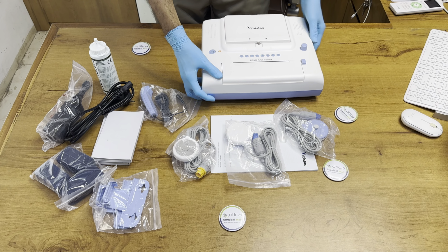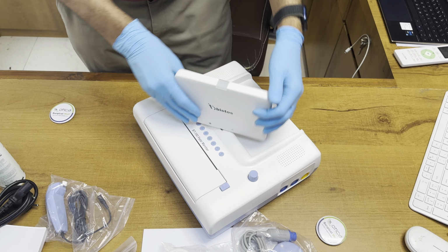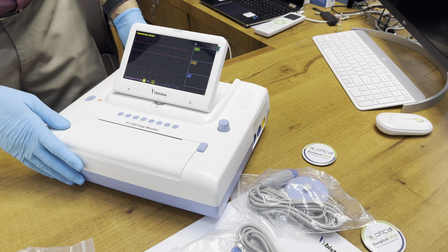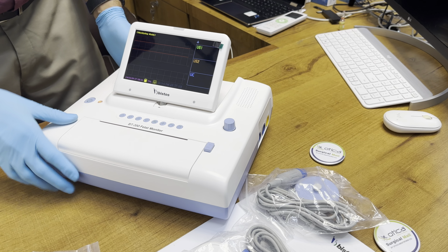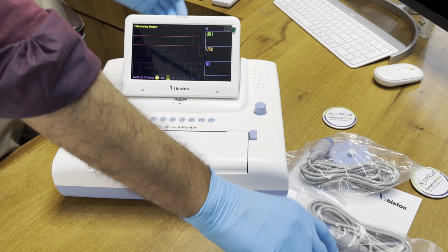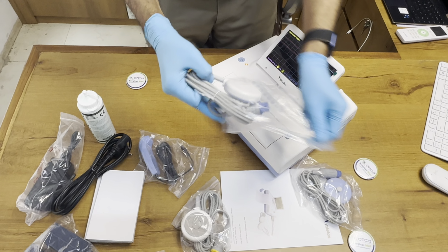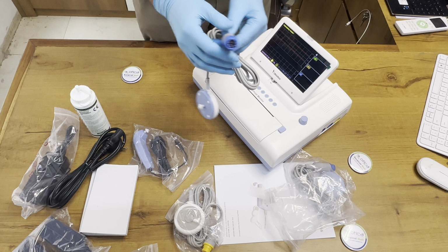So you can see this is the machine. The display is folding and rotatable, and we can adjust it according to our requirement. So this is how the various functions are given. This is ultrasound 1, ultrasound 2, and this is the tocography probe. So first of all, let me open the things. This is the toco probe. No, sorry, this is an FHR probe.